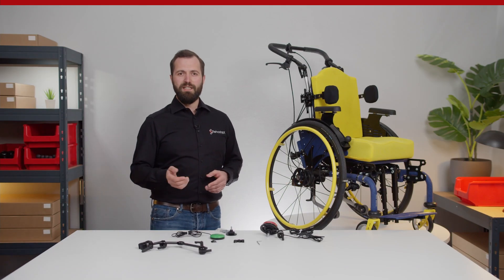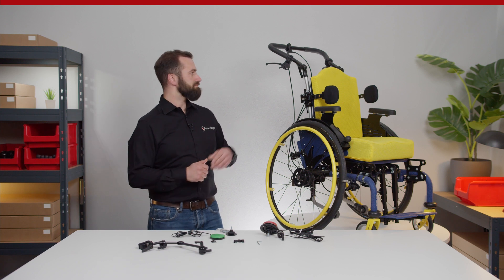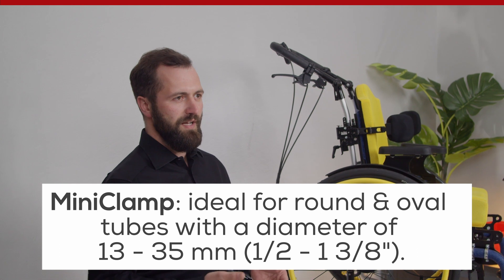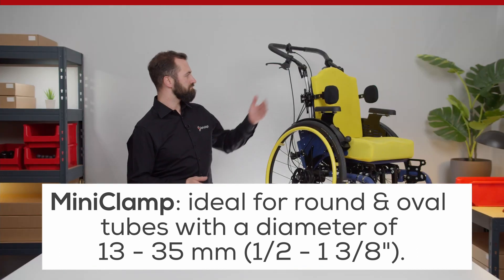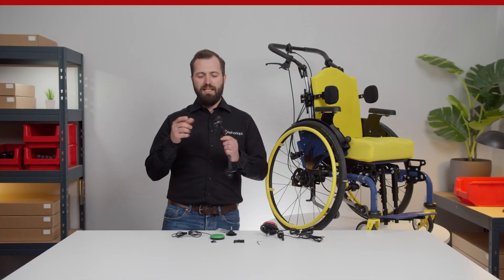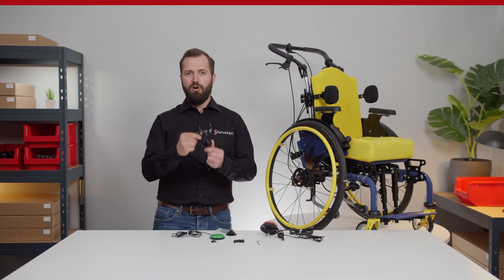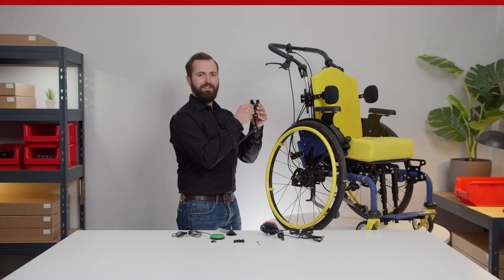To start with the installation of the mini clamp, you need to first identify a suitable spot on the wheelchair. Locate a round or oval tube with a diameter between 13 and 35 mm. A quick and tool-less fixation is possible due to the clamping lever. Open the jaw, position the clamp joint, and tighten the QuickShift lever.